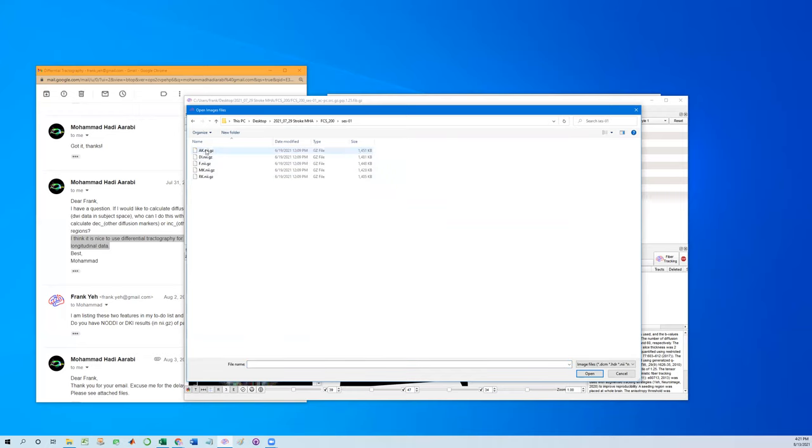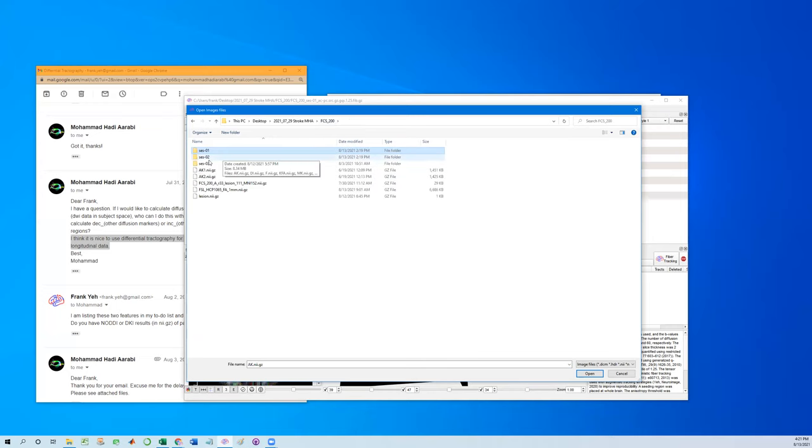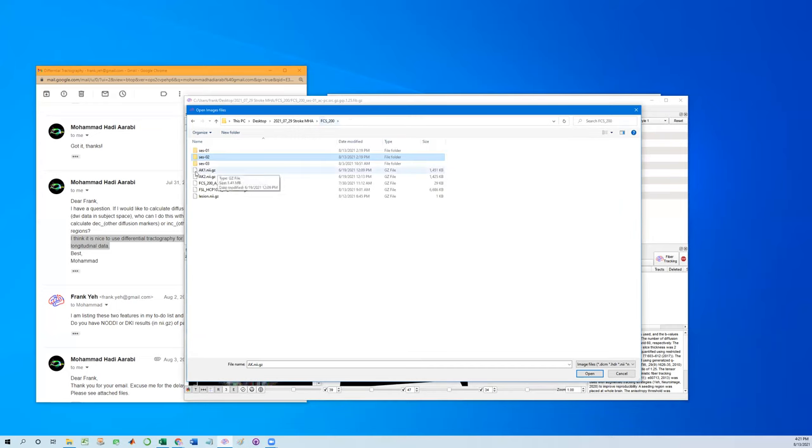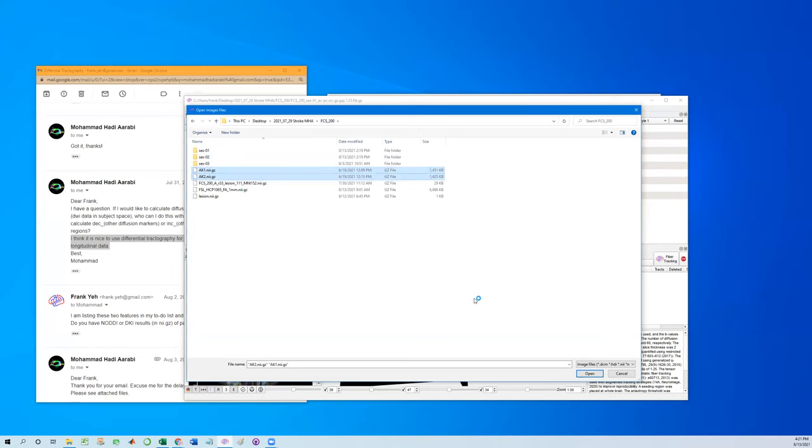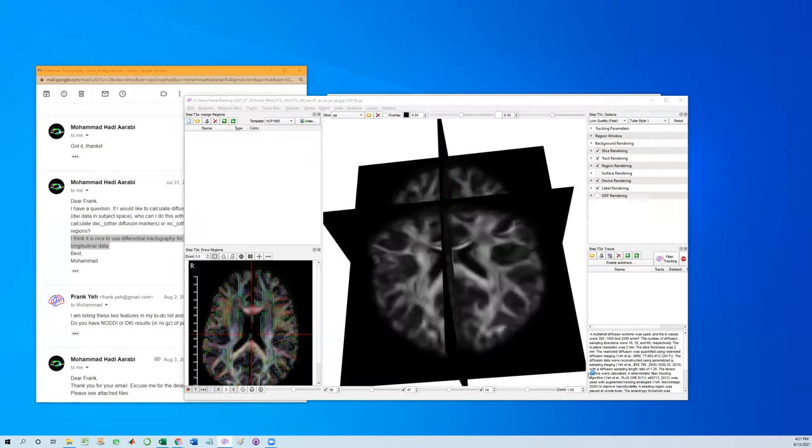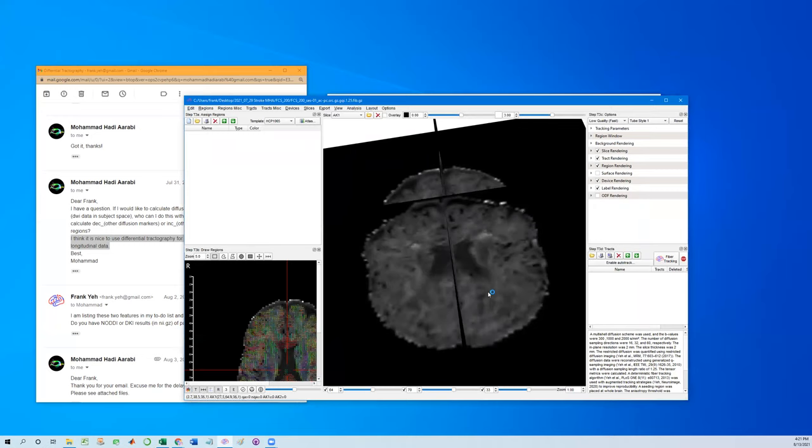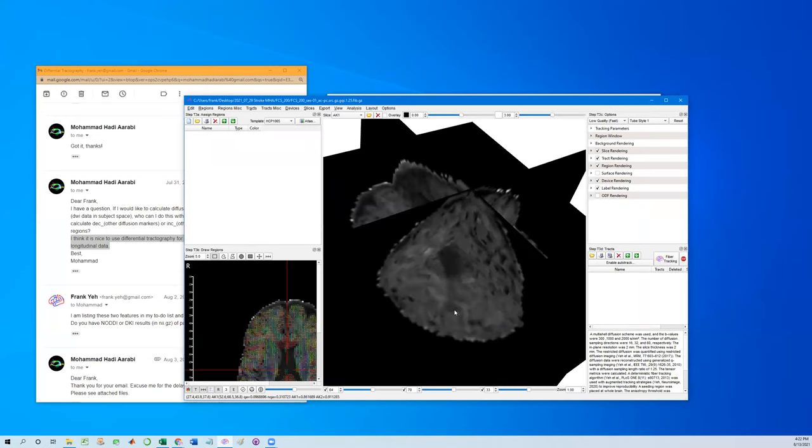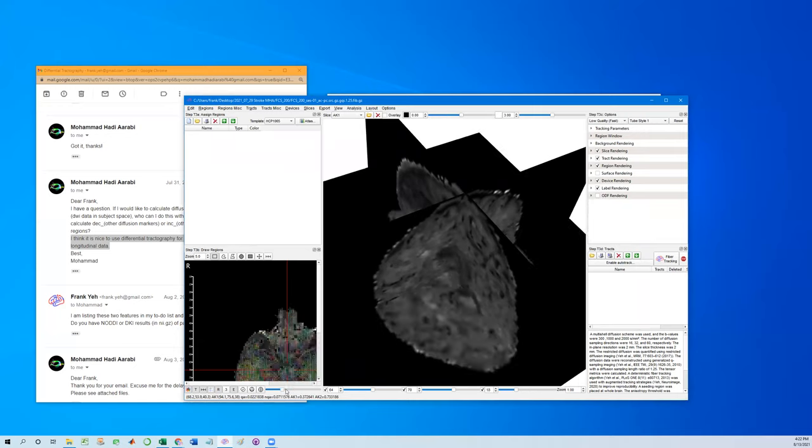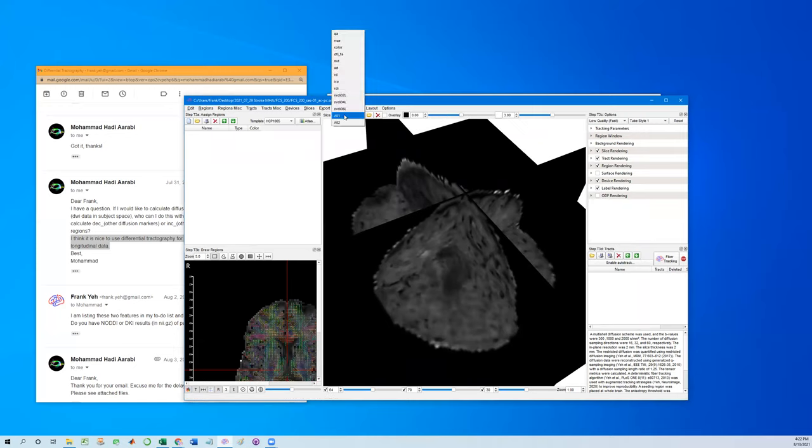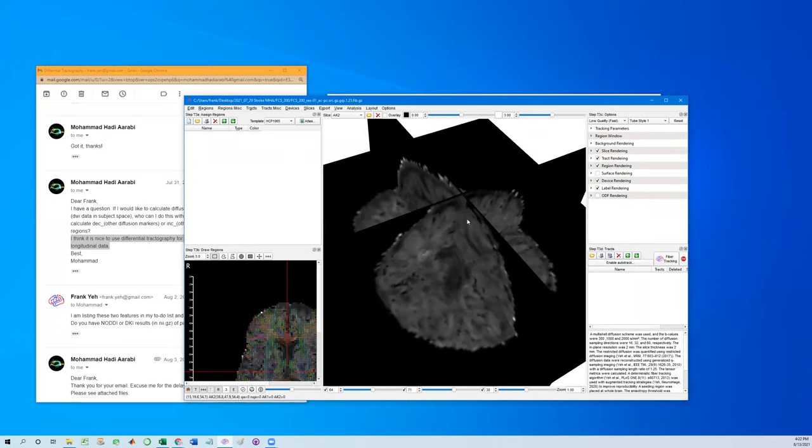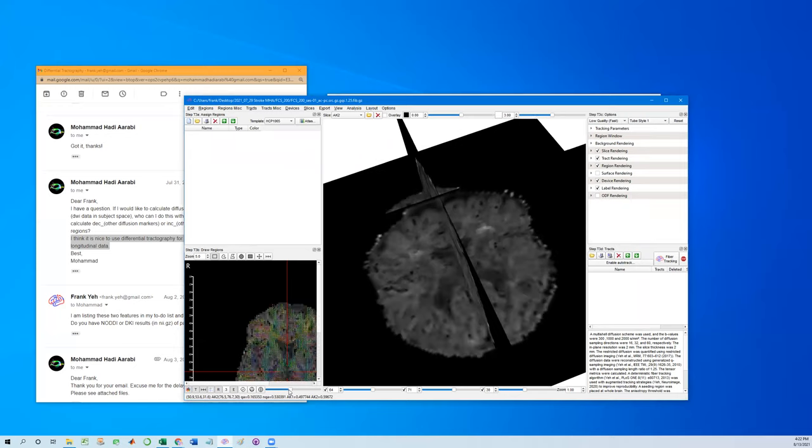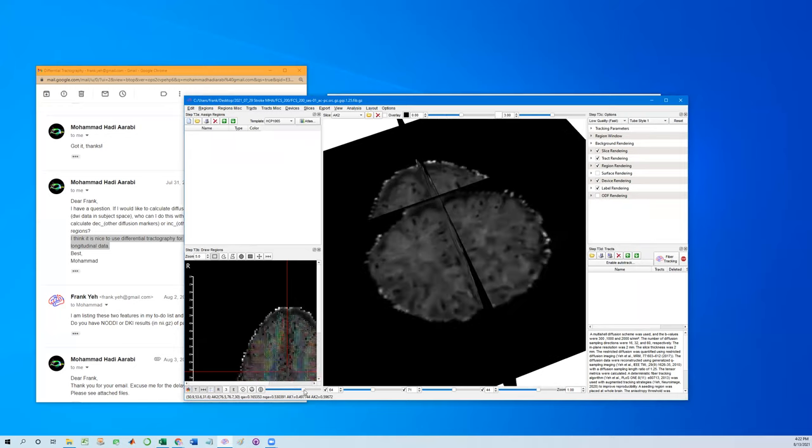So the first scan we have axial kurtosis and the second scan we also have axial kurtosis. To avoid confusion, I copy them here and rename as AK1 and AK2. Just select two of them and load them together.